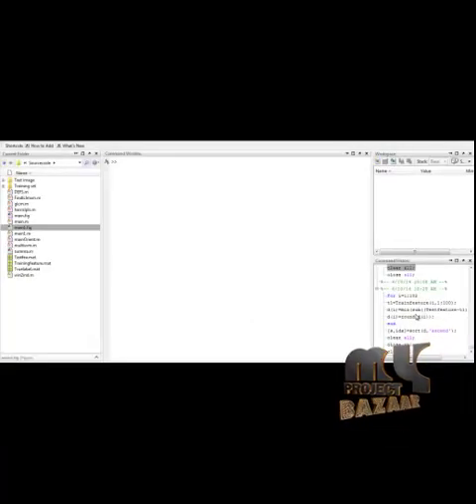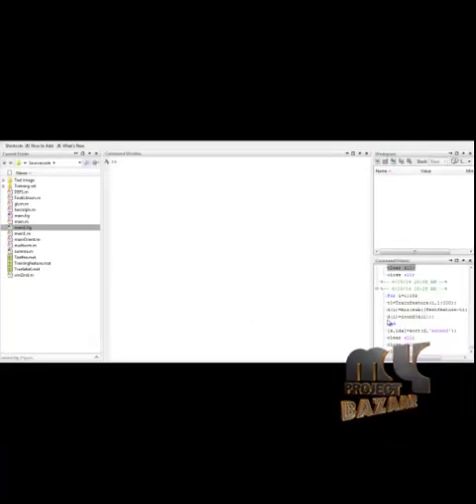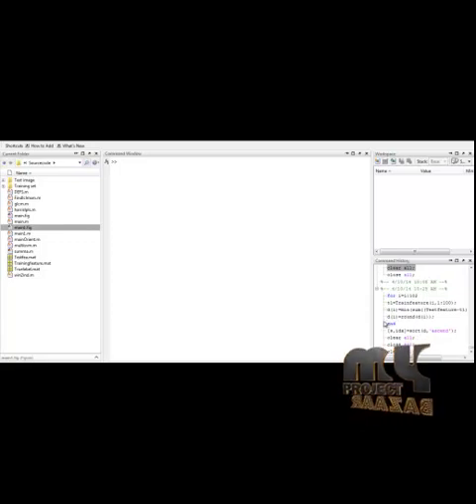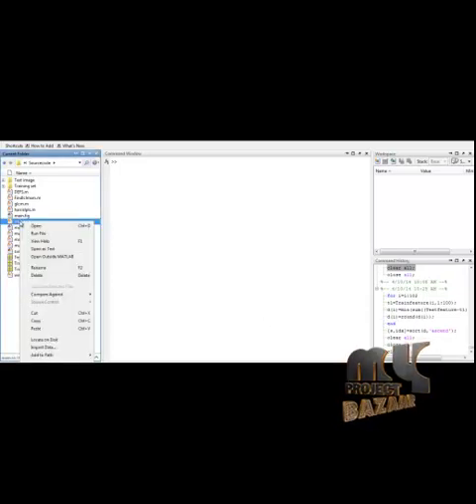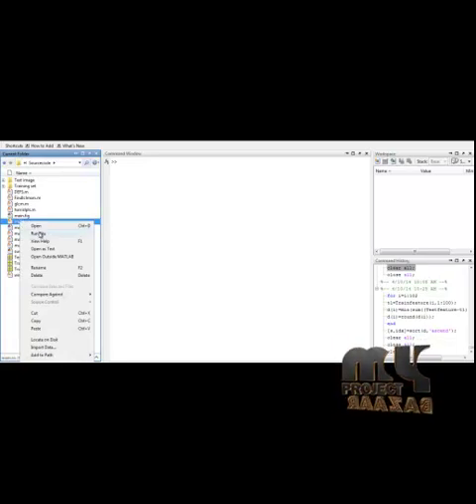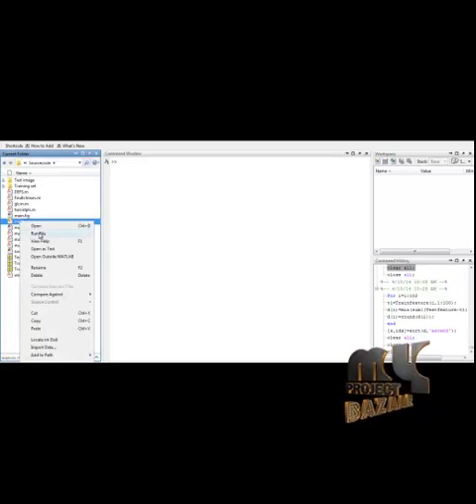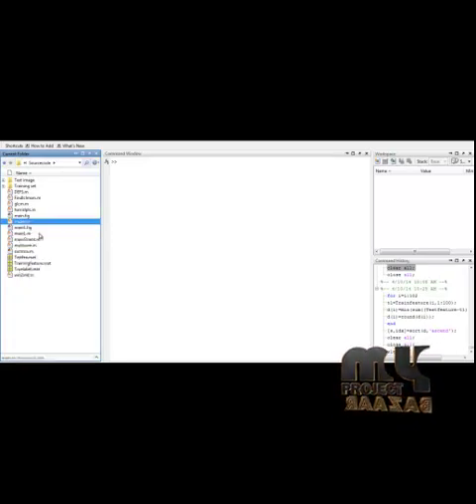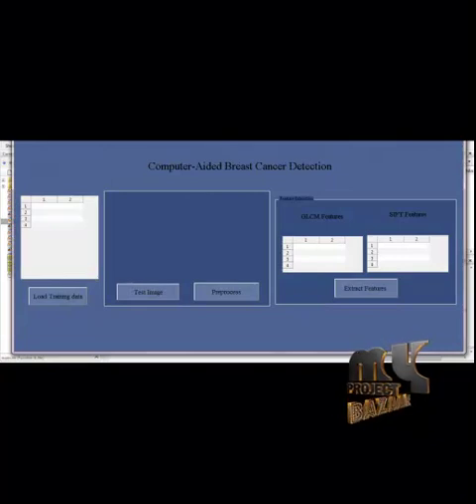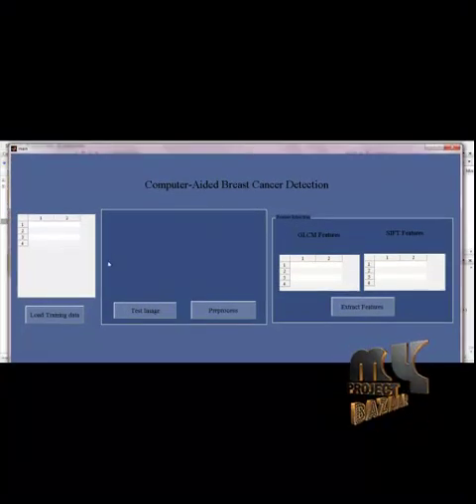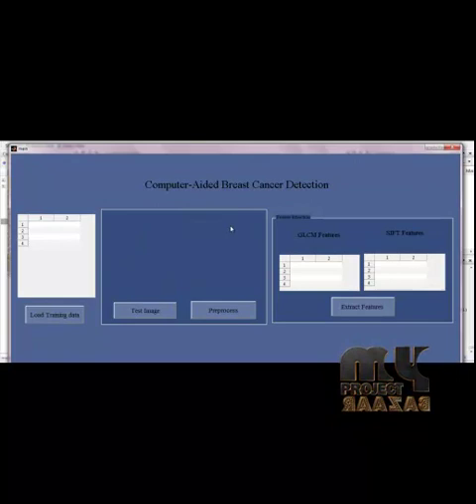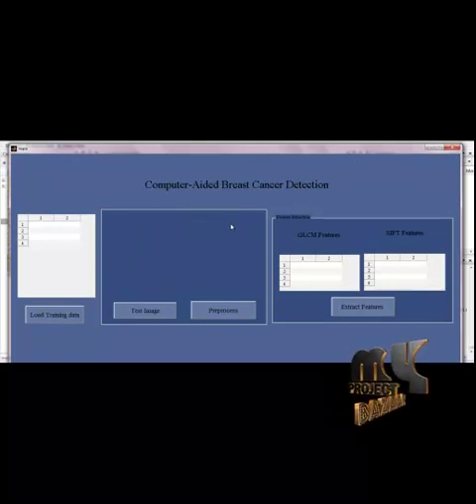Let me see the execution of the process. This is Computer-Aided Breast Cancer Detection Using Mammograms. To run the code, select the file main.m located in the source code folder. Right-click it and click on Run File. You will get a GUI window that contains all the user interfaces required to run the code.